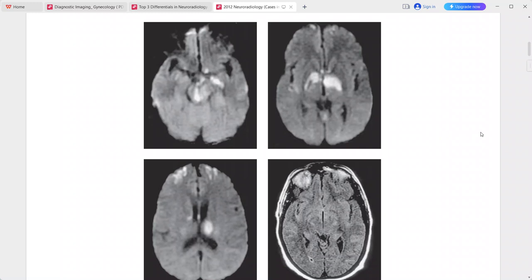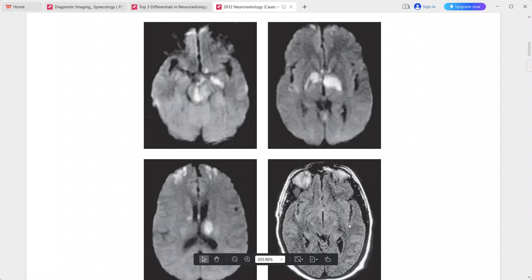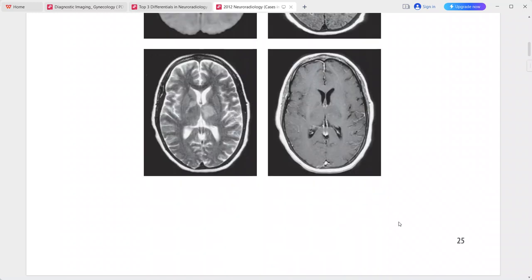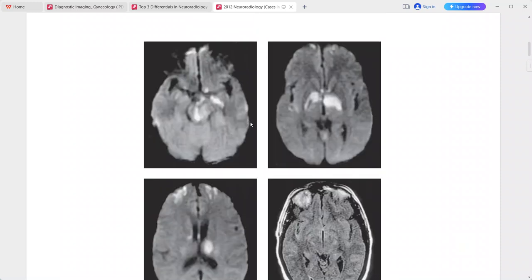On FLAIR sequences, there is subtle hyperintense signal in several sulci, a non-specific finding consistent with meningitis, subarachnoid hemorrhage, or elevated CSF protein. The post-contrast sequence shows no abnormal enhancement. Abnormal hyperintensity is seen in the putamen, lentiform nuclei, thalami, and internal capsule.